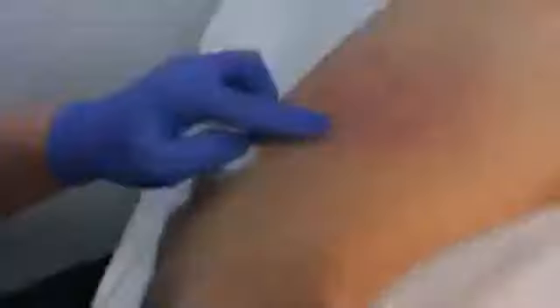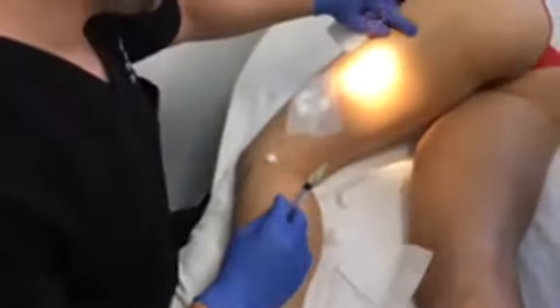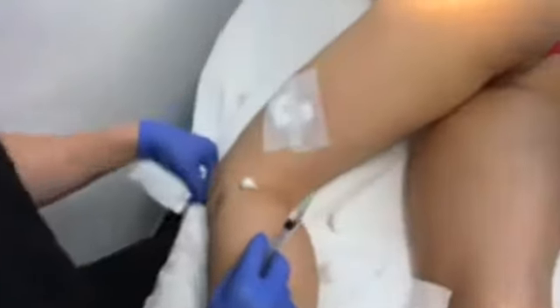I think it's crazy that some people just have bad luck. Oh my. Over here, just a small little piece. It's crazy. And since a lot of these are wispy small ones, unfortunately, a lot of times you have to wait until they're bigger, unless they're in patches like we just did.